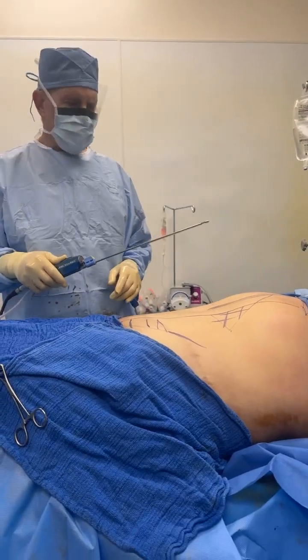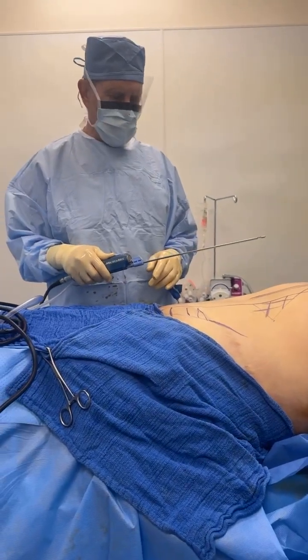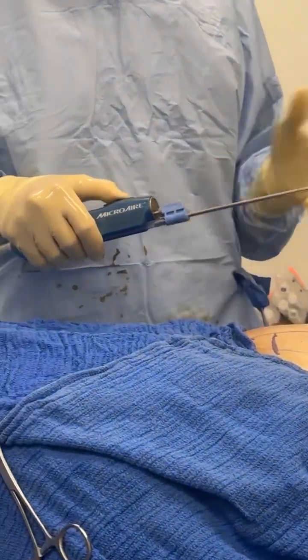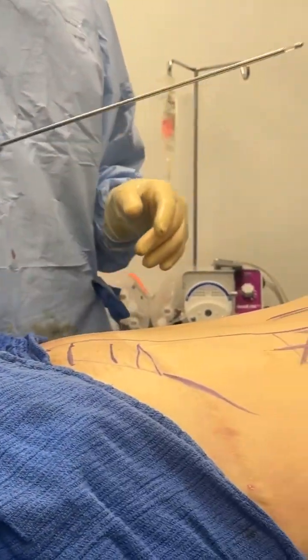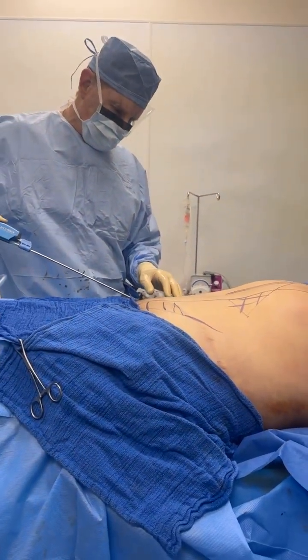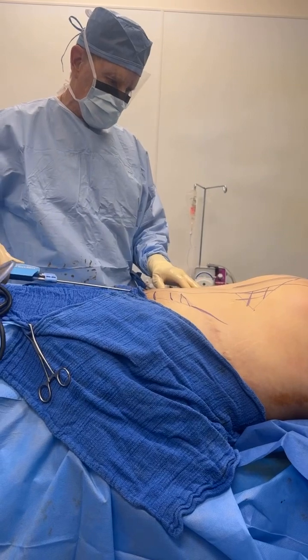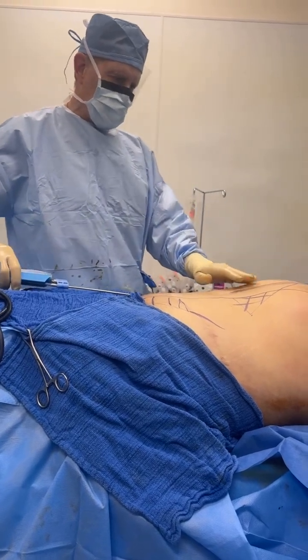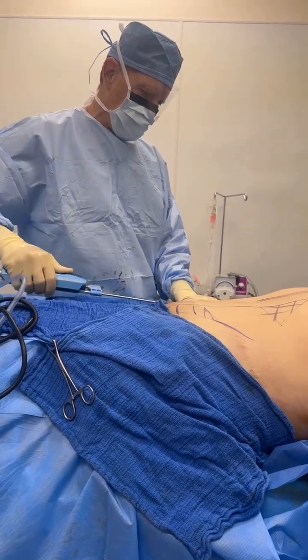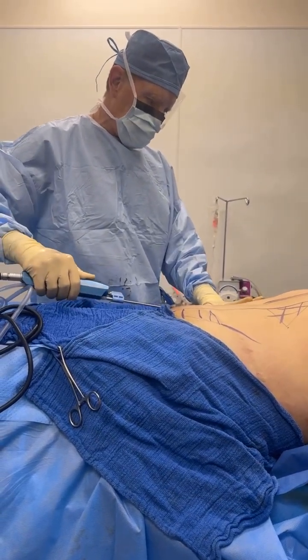Good morning, Dr. Patino here at the Cosmetic Surgery. We're going to do power-assisted liposuction. The cannula vibrates, it's like an electric toothbrush. And we're going to see what we do here. So we're going to do power-assisted liposuction to the inframammary, upper abdomen, lower abdomen, the flanks and the hips, and an ultrasound guided gluteal fat transfer.